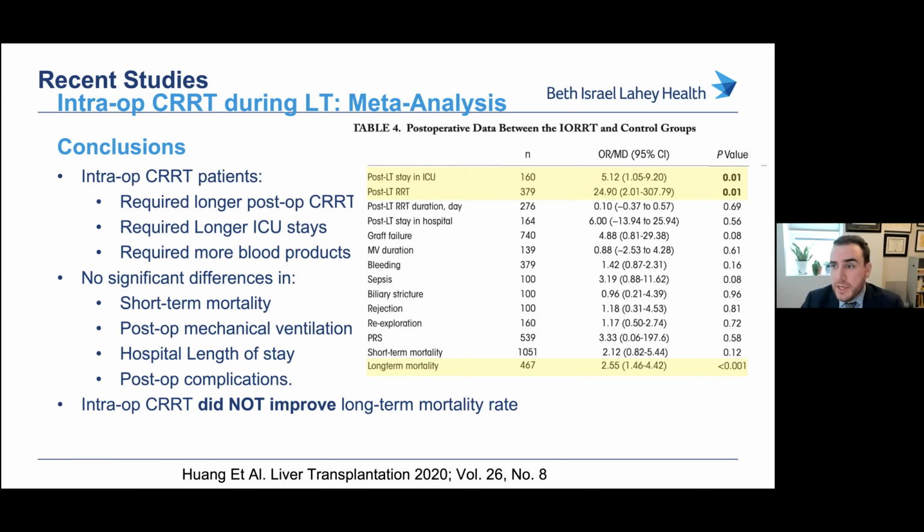It should be useful for reasons such as hyperkalemic arrest in the OR and volume overloaded post-op patients having complications. I don't know if intra-op renal replacement therapy has any correlation with the ability for a high MELD patient to get through a transplant, rather than enabling that person to live a long time.